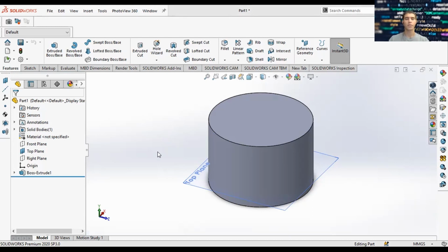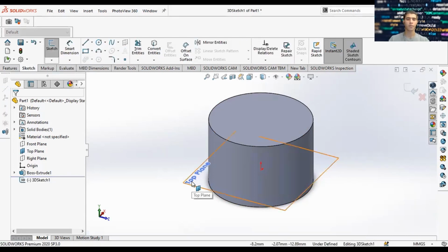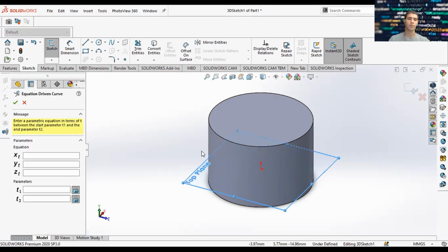The first thing you want to do for equation-driven curves is you want to have a 3D sketch. And so right now, we made a cylinder out of a 2D sketch because it's on one plane, the top plane. But when you make a 3D sketch, you're defining it in 3D. And so it brings in a bigger variety of tools that you have at your disposal when you have a 3D sketch versus having a 2D sketch. So we here declared a 3D sketch on our top plane. And now we're going to include an equation-driven curve.